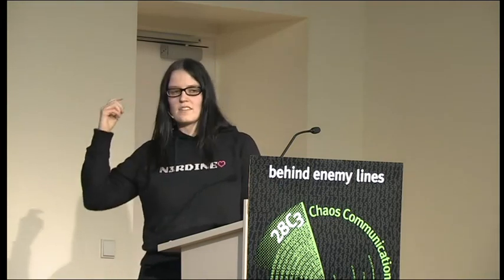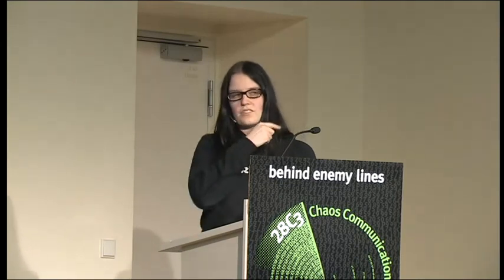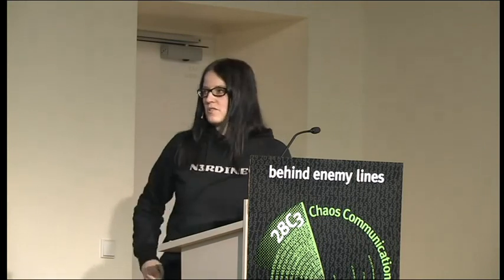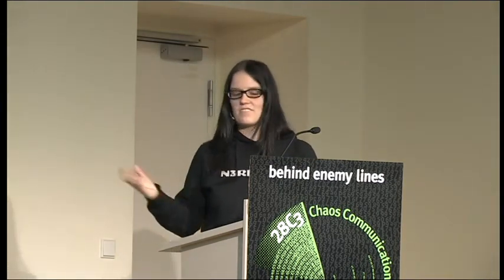And something that is not directly about the tech: the hearing aids also communicate with each other. There's a small switch on my hearing aids, and if I switch between the programs on one ear, it also tells that to the other ear. And that one doesn't use authentication. I have heard that when people have the same model of hearing aids and are close to each other, for example when couples buy the same hearing aids, then you switch your program and your spouse also gets the program switched. This can only be changed by the audiologist by changing the channel. Like in wireless LAN, they have different channels and you set it to a different one. That's the security about that.